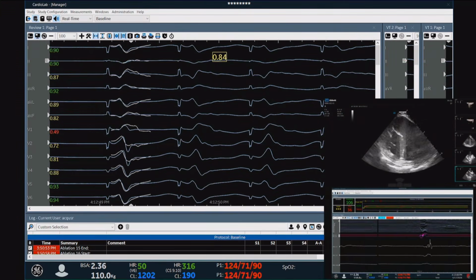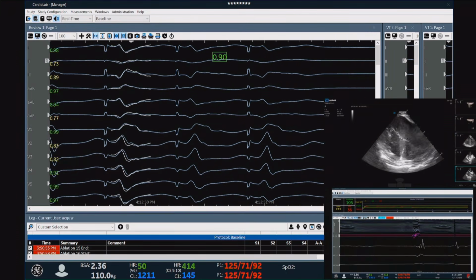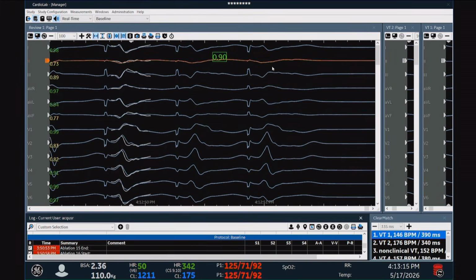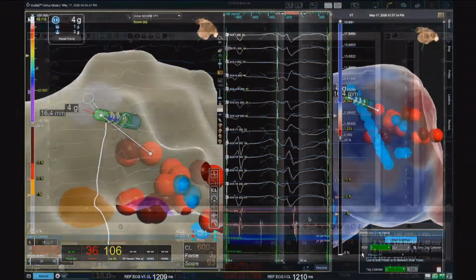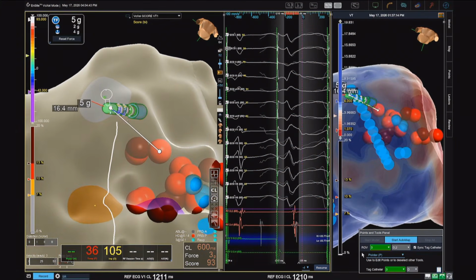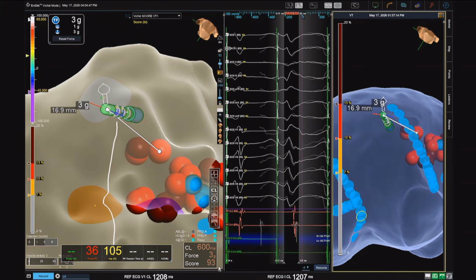And here, you see, we are close to the VT exit. 90%. So generally we should somehow bombard more. Can you show the inside score map here? Can you move to inside, please, again? So this is the other part of the channel. You see in the inside the shadow of the VT, and in white, the scar map. It seems that the other part of the channel is the exit of the other VT, but probably the isthmus is exactly the same.